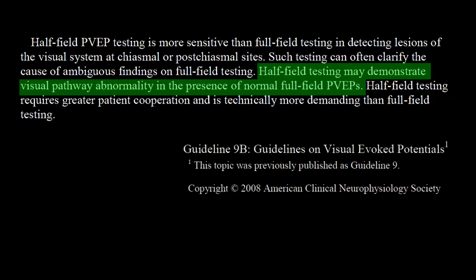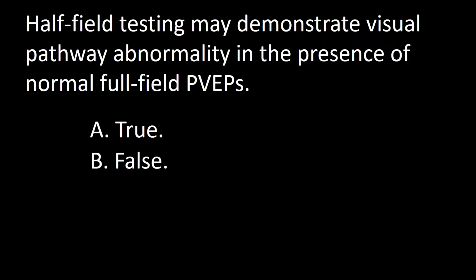This view is not shared by others in the business. That is the reason they recommend half field to be done only when full field is abnormal or questionable. So the answer to this question is true.